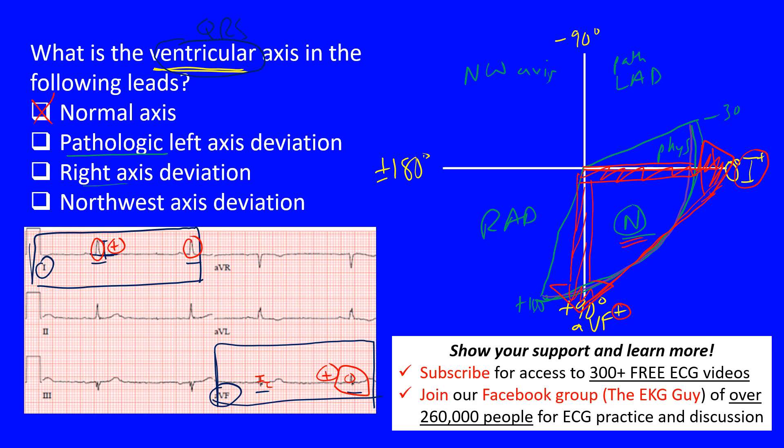Another lead that's helpful to look at is lead II. Lead II sits here at positive 60 degrees, so lead II's positive end is at positive 60 degrees. If you look at lead II on our ECG, it's this one here. You can see these are mostly upright positive complexes, meaning that we'll go towards the positive end of lead II, confirming that our axis lies within this region.